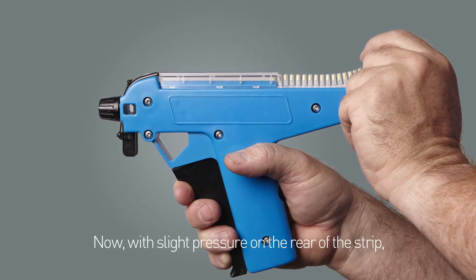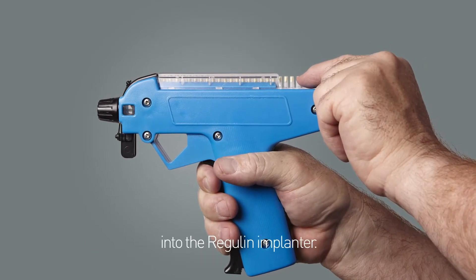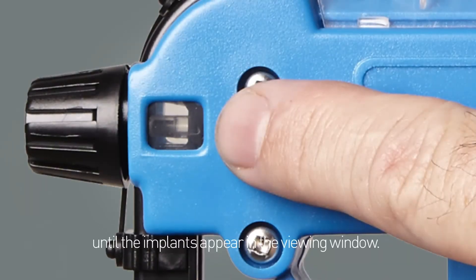Now, with slight pressure on the rear of the strip, depress the trigger to fully engage the implant strip into the Regulin Implanter. Continue to depress the trigger, normally 5 clicks, until the implants appear in the viewing window.